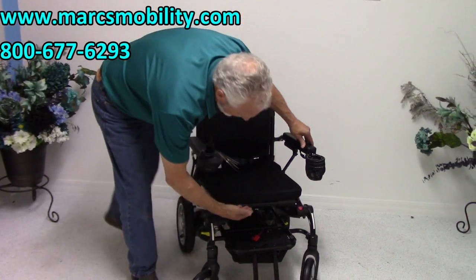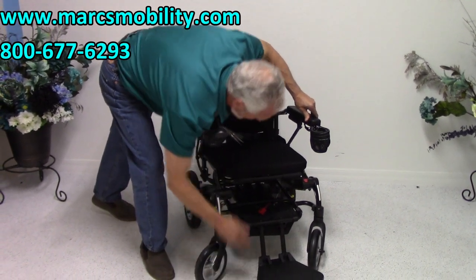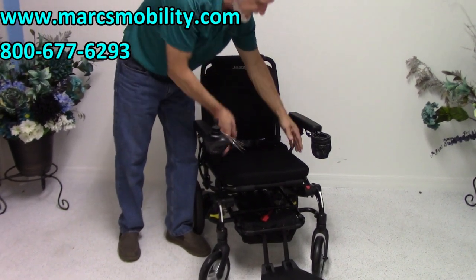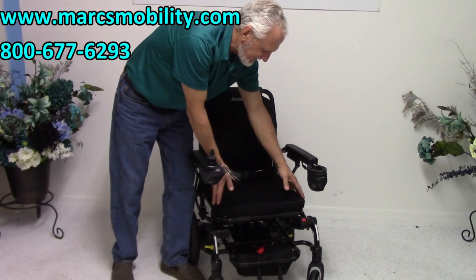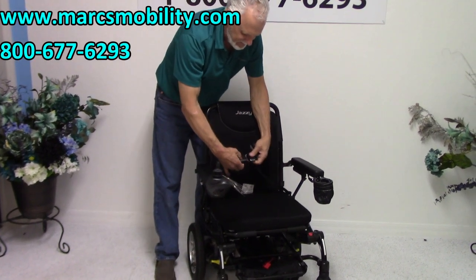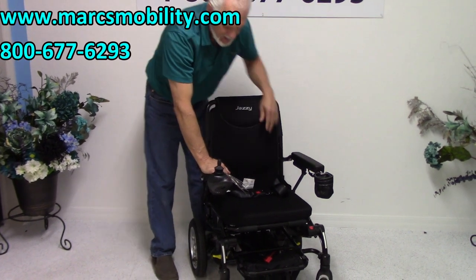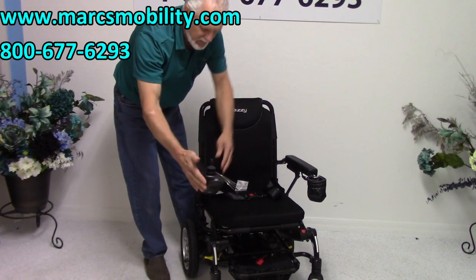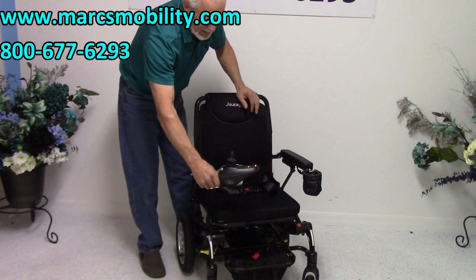The seat height from the seat pan to the ground, without the cushion, is 19 inches. The seat itself is 17 and a half by 16 and a half inches. It comes with a safety belt, and there's a drink cup holder right here. Your joystick is on the right side and has a swing-away feature. If you're left-handed, we can put the joystick on the left side.